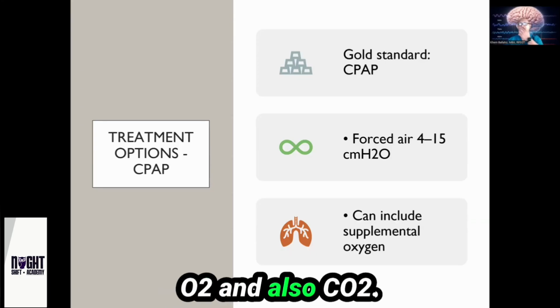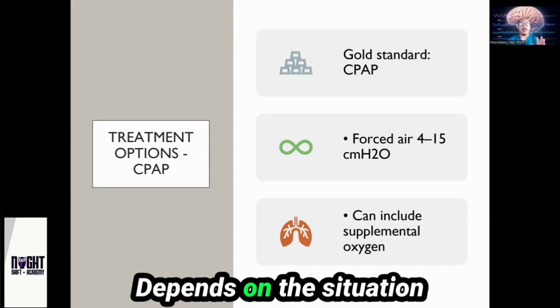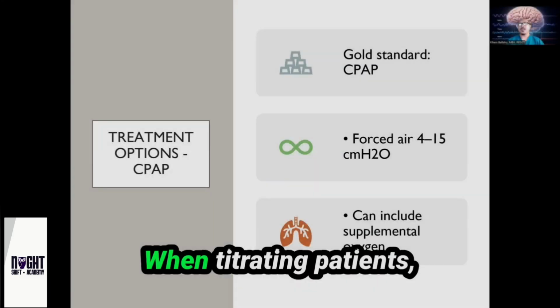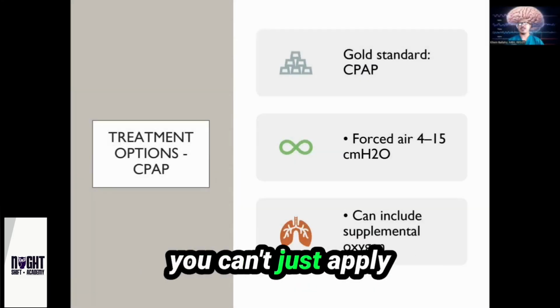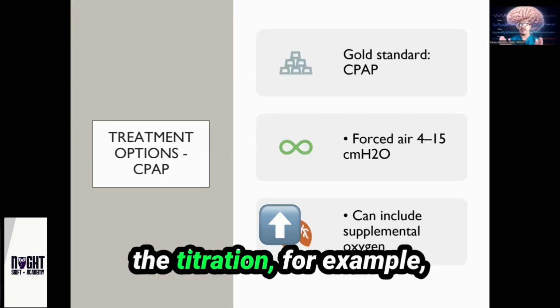Supplemental O2 and also CO2. So it's not as simple as that, right? It depends on the situation as well. And when titrating patients, you can't just apply supplemental oxygen if you haven't maximized the titration.